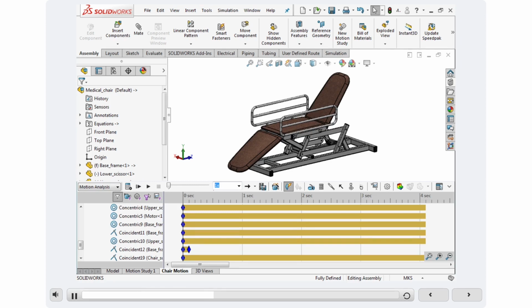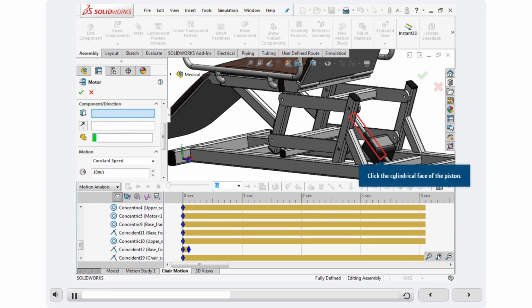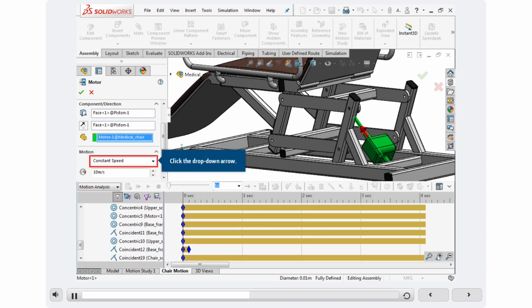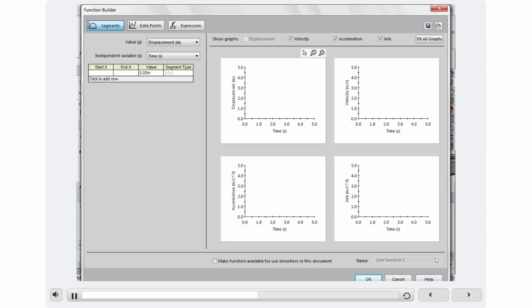Now, we will create a motor that drives the piston. Click Motor. Under Motor Type, click Linear Motor. For motor direction, select the cylindrical face of the piston. Click the Component to Move Relative to field, and click the Motor component. For motion type, click the drop-down arrow and click Segments. Retain the default values for value y and independent variable x. Add a row in the table to enter the values by clicking Click to add a row.